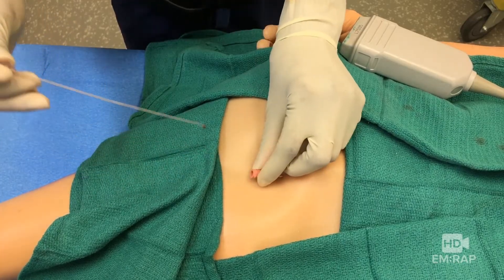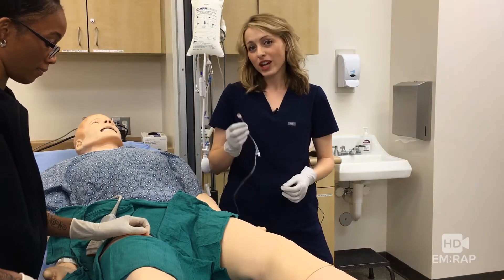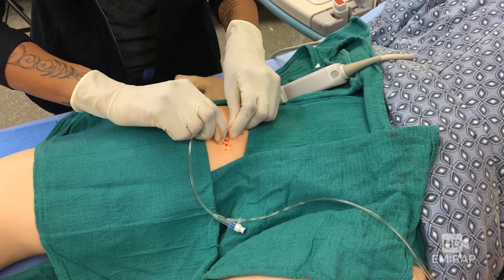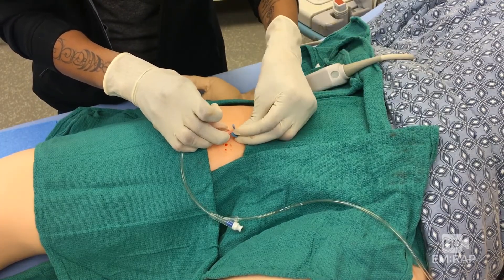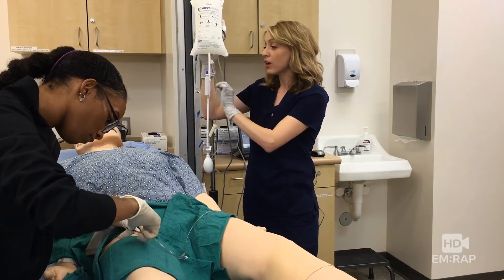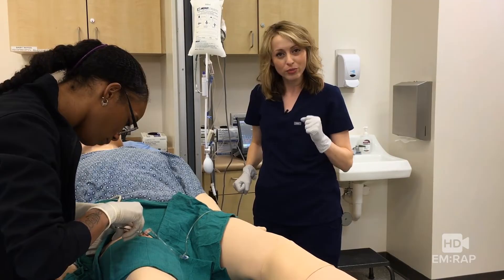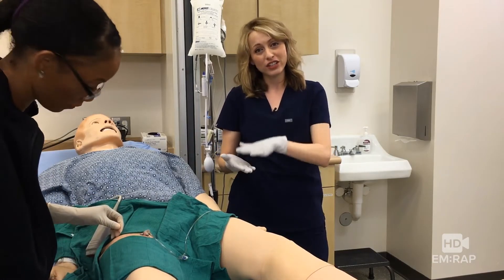Remove the guide wire and just cover the catheter with your finger to limit blood loss, but honestly, it's going to bleed. Double check that your nurse flushed the line thoroughly, and now connect the transducer line to the arterial catheter. Once secured, use the blue piece to suture it down. It's a half-liter bag of saline blown up on a pressure infuser to 250 to 300 millimeters of mercury. Connect to your monitor and you can start transducing that arterial pressure. Once it's all secured, dry the area very thoroughly and secure it down with a dressing.